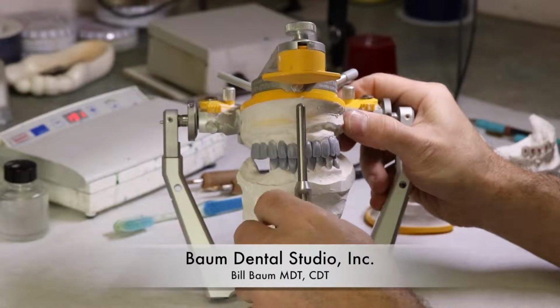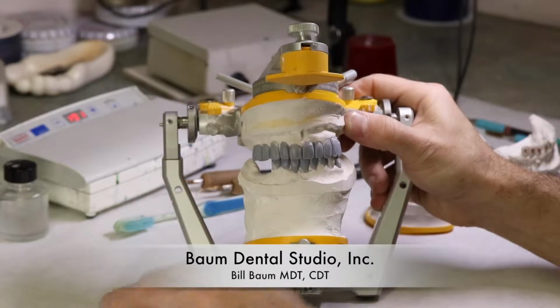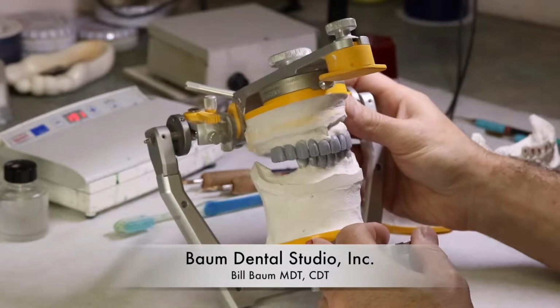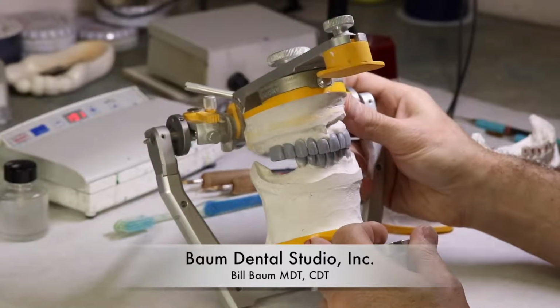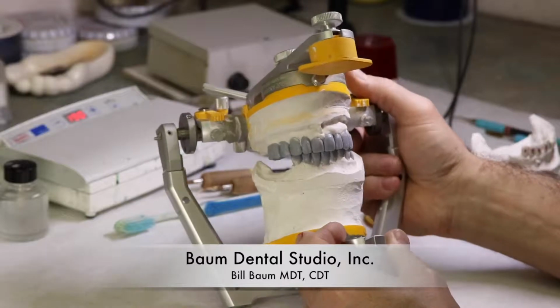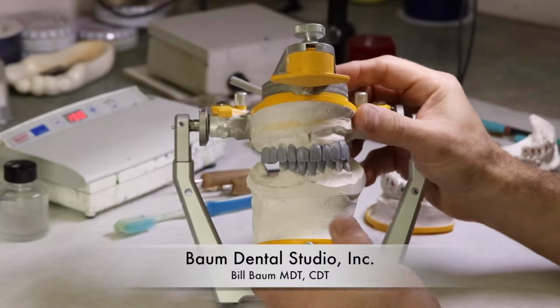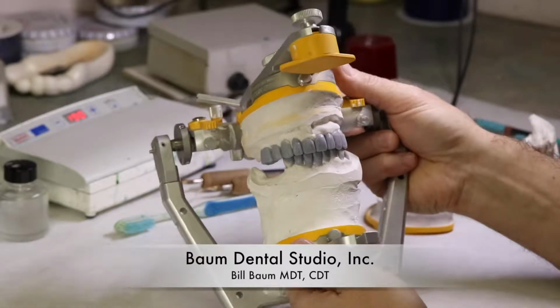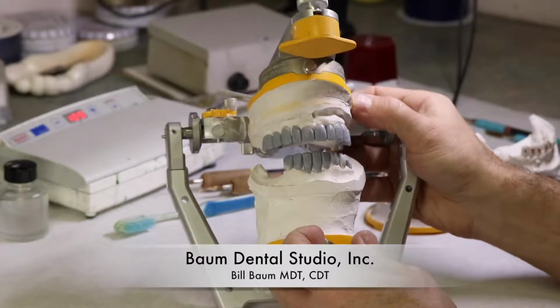That's what I came up with for the moment. With any diagnostic wax up, I usually always find things that I'd like to improve upon. But this seems like a reasonable starting point to build the restorations.